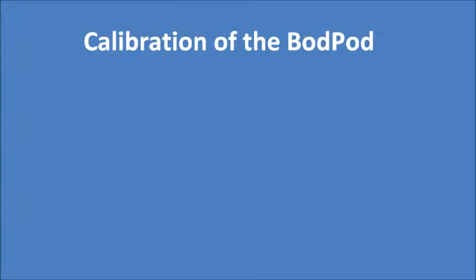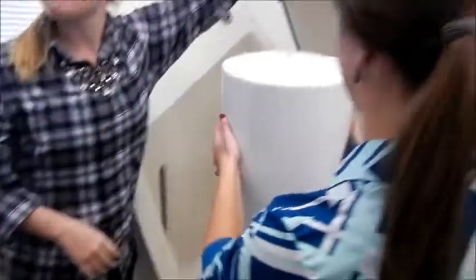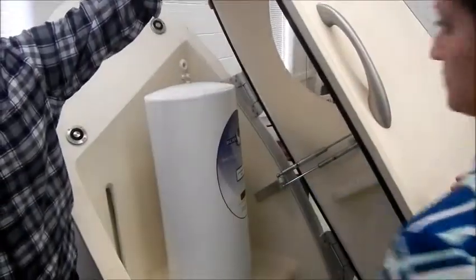Calibration of the bod pod. The bod pod is calibrated using a cylinder with a specific volume and weight.